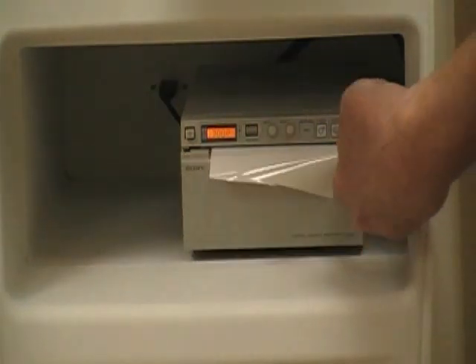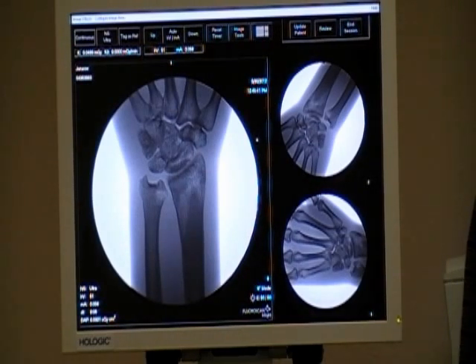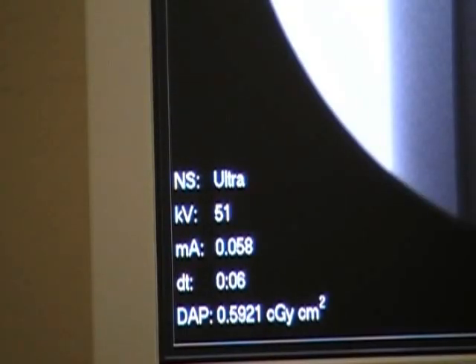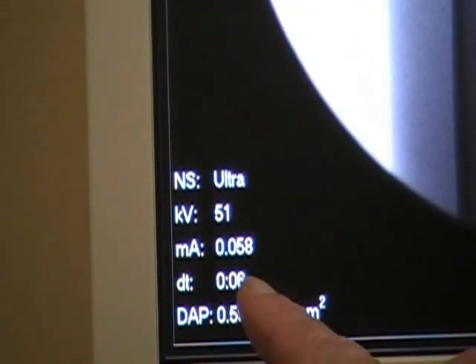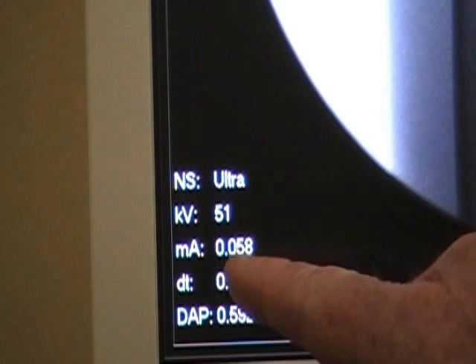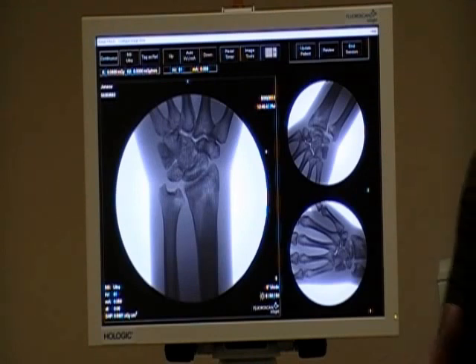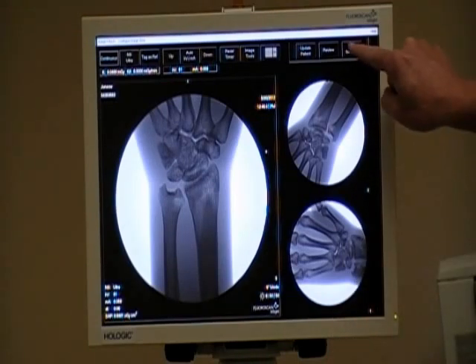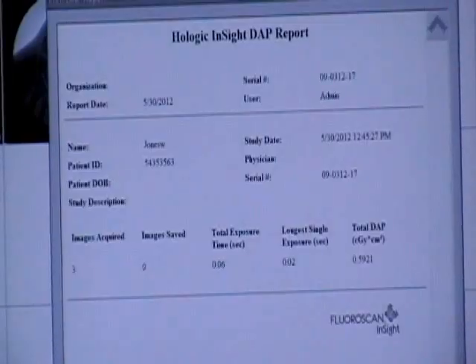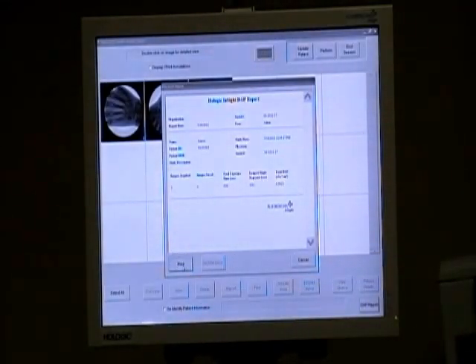To log patient times, in the lower right-hand corner it gives us our usage. DT is the duration time — we've used it for six seconds on this case. It gives us our KV and MA; those are what you put in your logbook. Another way to track patient data is by going to the DAP report. From the Review screen, go to the DAP report and it will show the actual exposure time and everything relevant to the case. If we hit Print, that prints out and we can post it into our logbook.